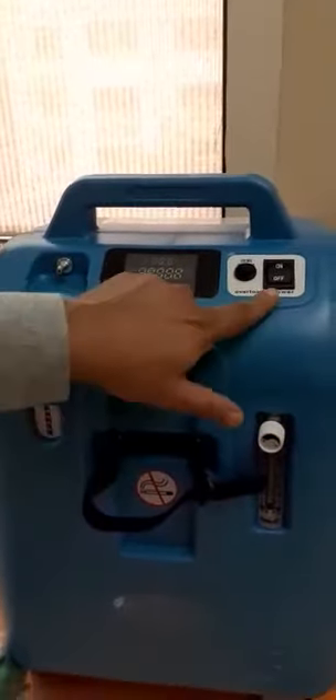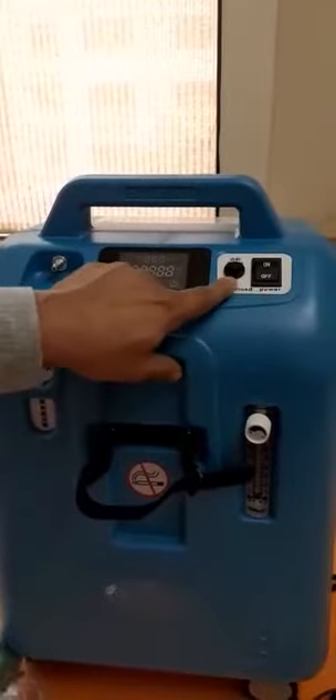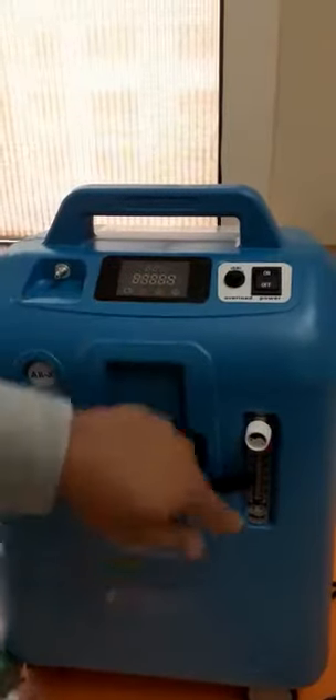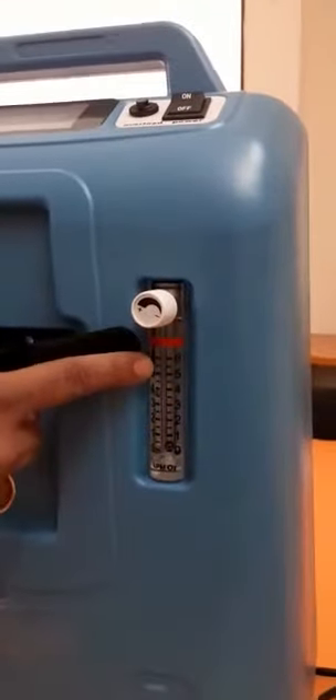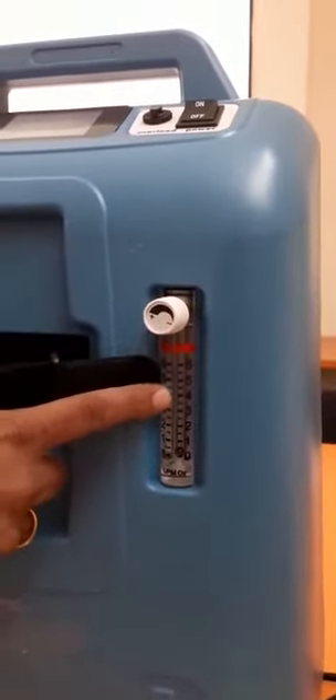Now let's look at the machine. Here is the digital interface, there is an oxygen outlet, a power button, and this is a circuit breaker. This is an oxygen measurement flow tube, in which you can monitor how many litres of oxygen per minute you need. There is also an adjustment knob, and here we put a humidifier bottle.